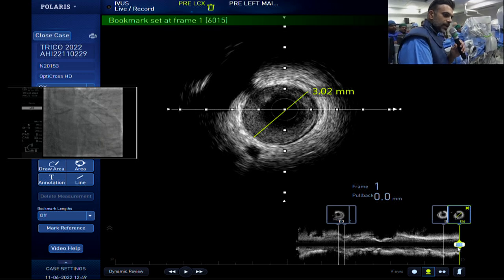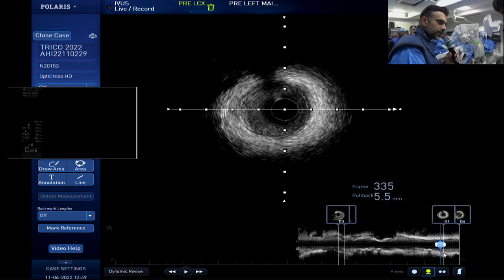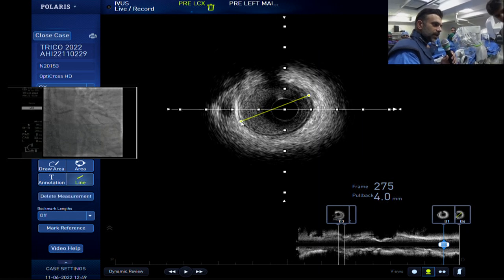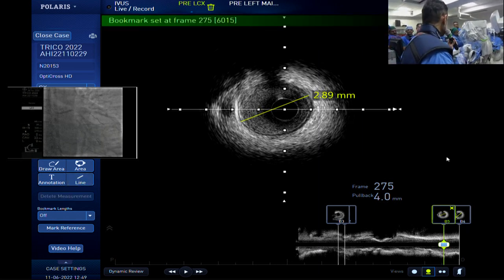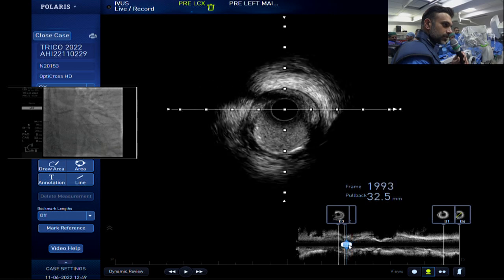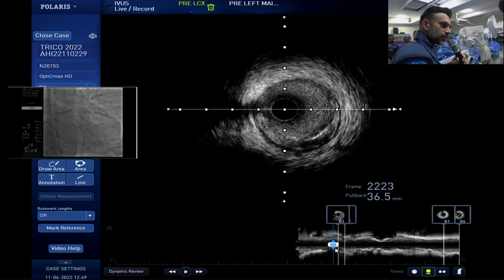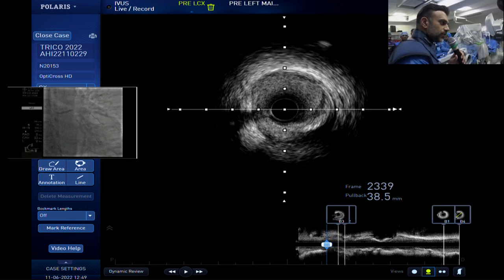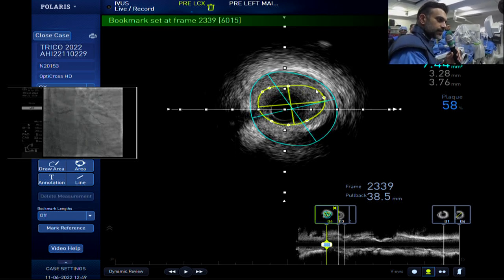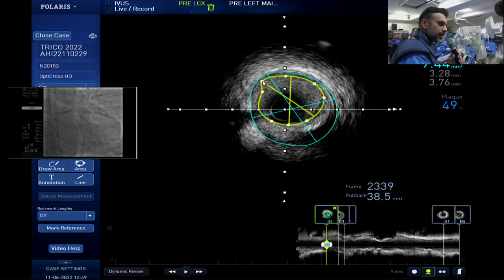Now, let's scan back, okay? And your disease starts here, right? So let's come a little bit more distal to that. So roughly B1, right, within that safety zone, you can guarantee yourself that a 2.5 stent's going to be just fine. Okay? Then as you pull back, you've got your lesion here. It's a fairly long lesion. Okay? And now here's your bifurcation point. Here's your landing zone. You've got some plaque here, right? And you can use the trace assist piece and optimize the analysis, and you'll get a handle on approximately how much plaque there is.